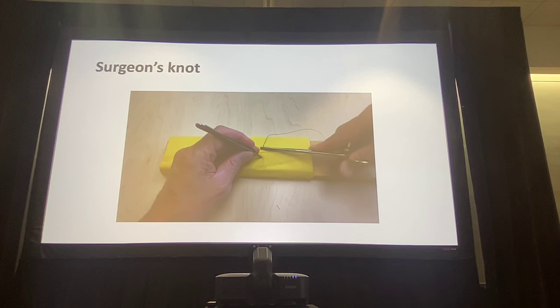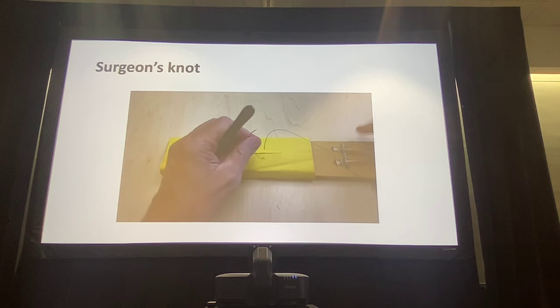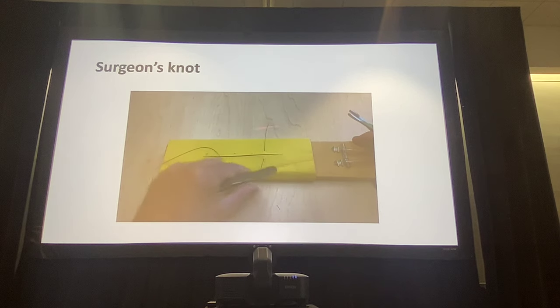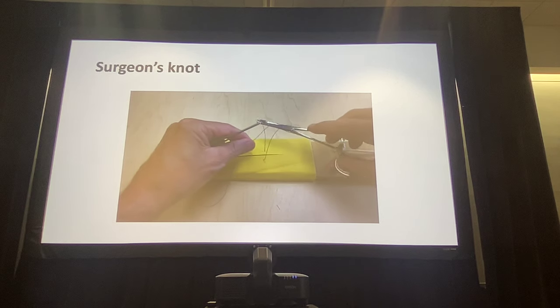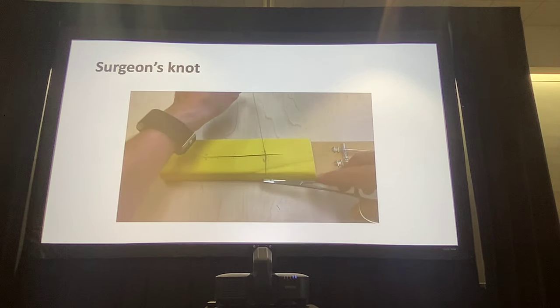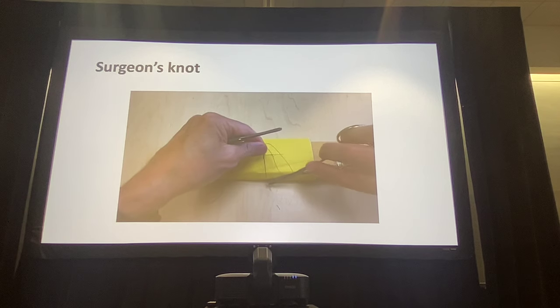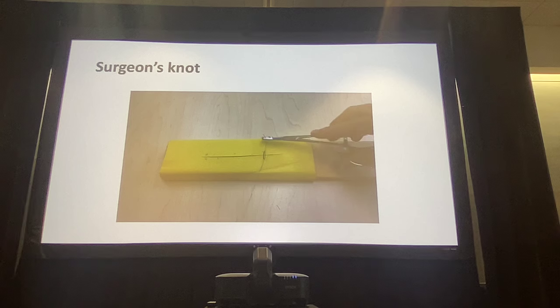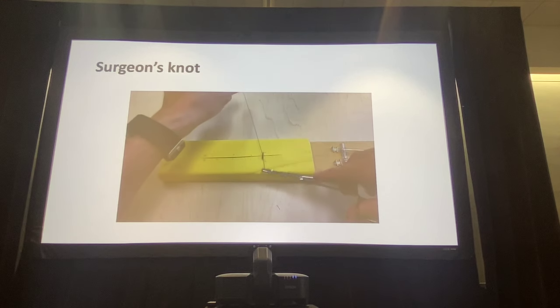So a couple of pointers I'll mention while we're working on this, just to keep things in mind. These are obviously prosthetics, but if you notice, the prosthetics are not anchored down to the table, right? And with a real patient, you want to try and be cognizant of where your wrists and your forearms are in relation to that patient's skin. Every time you touch the skin of an animal, you're potentially contaminating your surgical site with bacteria that normally live on the surface of the skin.